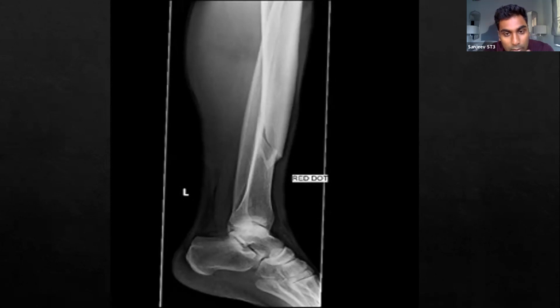Yes, thank you. Great, thank you. And what was the second question? The second question was, would you need other views to be sure on the displacement, etc.? Yes, you would, absolutely. Which is why in your OSCE, if they're giving you one view, you can only comment on that one view. But that's why it's really important when you're concluding in the end to say, okay, this is the fracture that I've seen, but I would like an AP view to assess further.